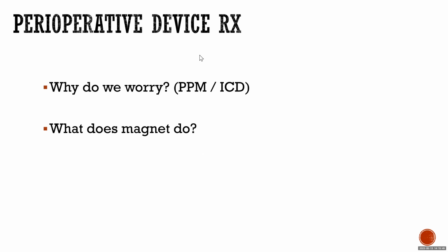So what happens if you apply a magnet to a pacemaker? DOO, exactly. So it will pace, it will not sense anything. It will just keep pacing, asynchronous pacing, or VOO, DOO. Good, this is for pacemakers.